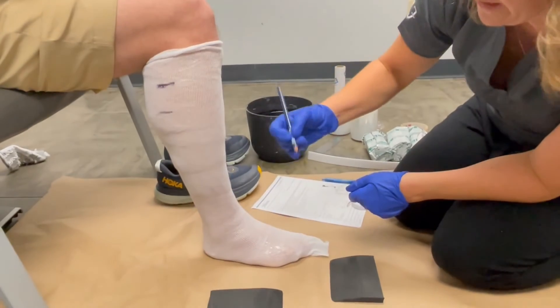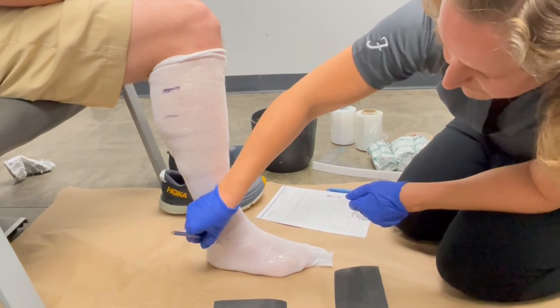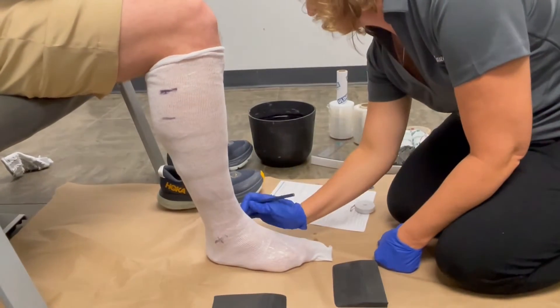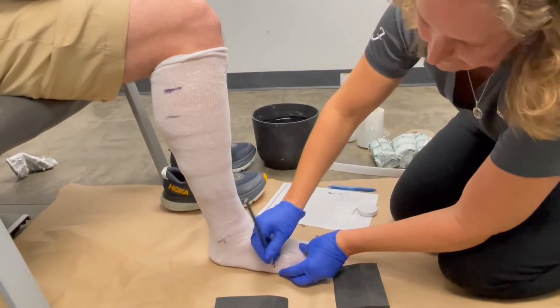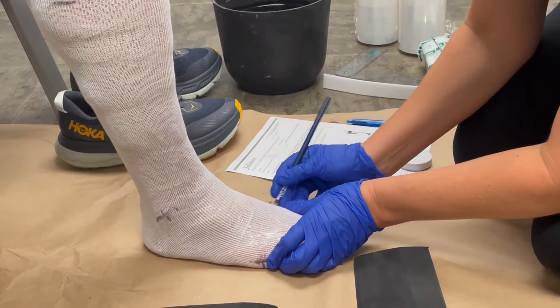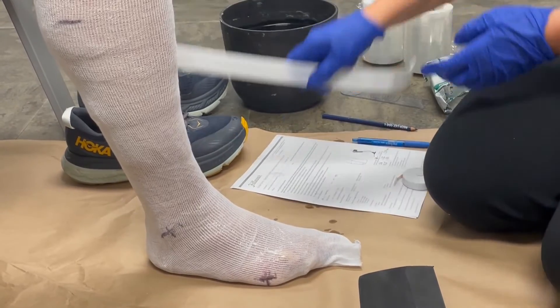I also want to mark on the cast where I have my malleoli, and where I have my fifth and first metatarsal heads. Now we're going to get casting.